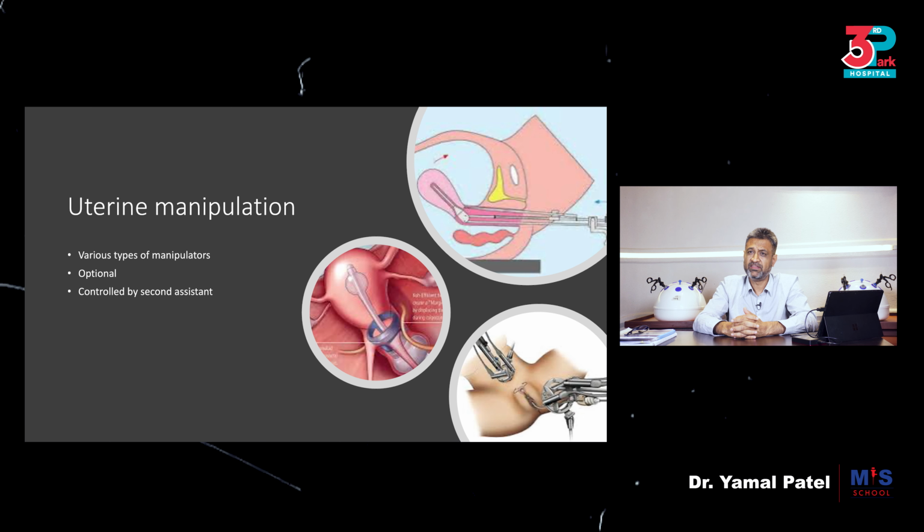Initially on entry, the procedure begins with the patient in the flat position, and you decide on your port placement based on the pathology. So a uterus, as it grows bigger, wider, might require different positioning of the ports.